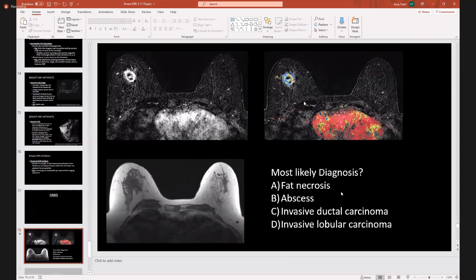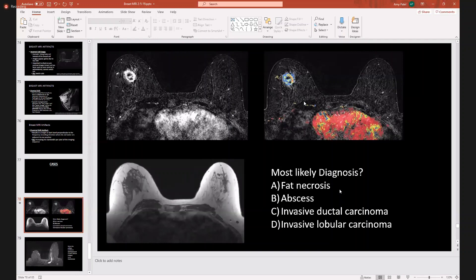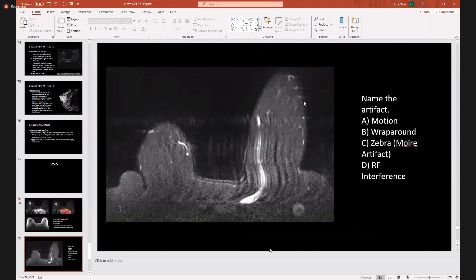Quickly reviewing a case: the most likely diagnosis is invasive ductal carcinoma, as IDC is the most common breast cancer. We see an enhancing mass demonstrating mixed kinetics with a washout component. There is nothing enhancing on the T1 non-fat suppressed image. The artifact here is motion — the patient is moving around, there is a lot of signal loss, classically a motion image.